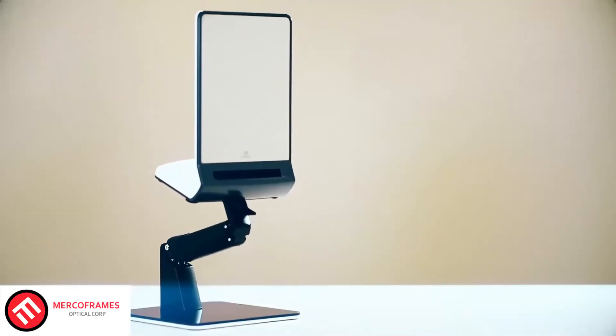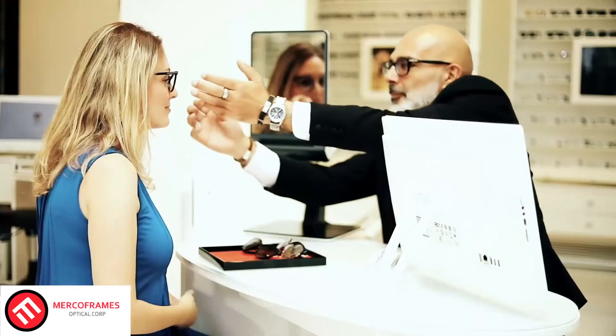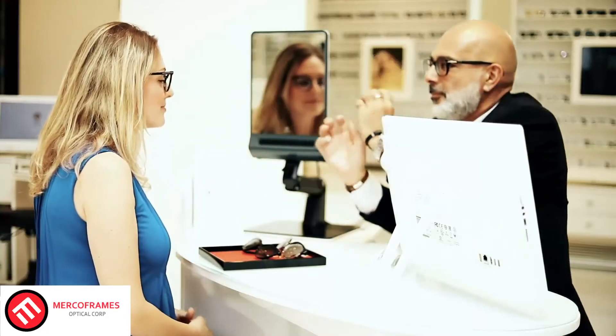An adjustable arm lets you position the mirror accurately in front of your client, allowing your client to sit comfortably with a natural head position. Your client looks in the mirror wearing their glasses, with no jigs on.